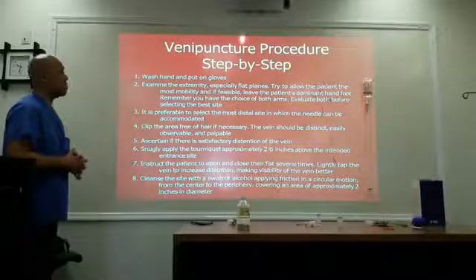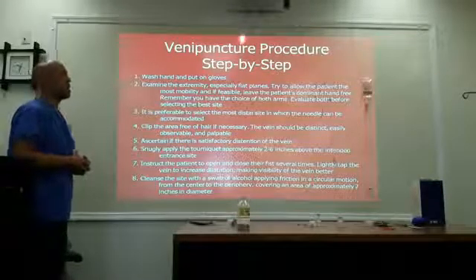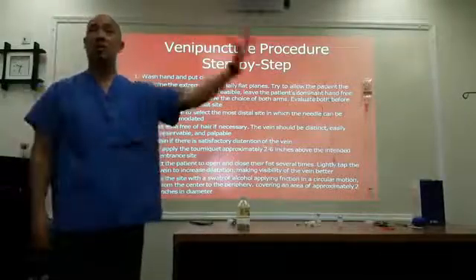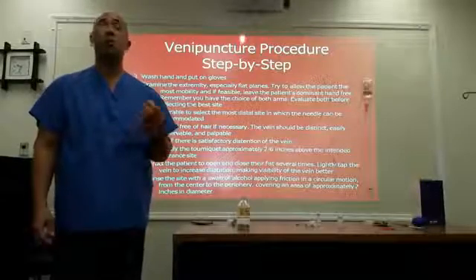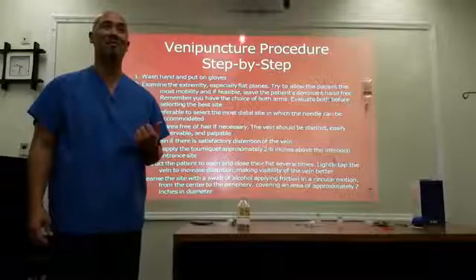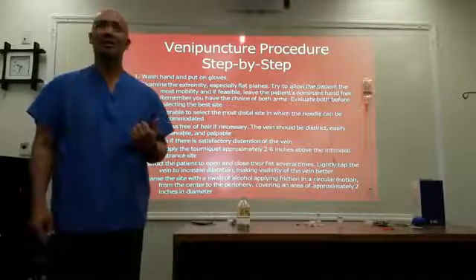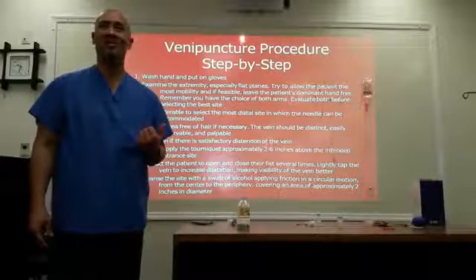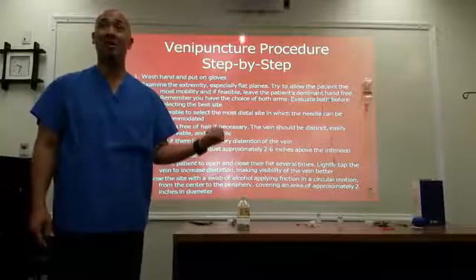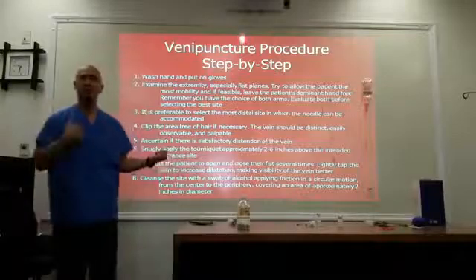Try to allow the patient the most mobility if feasible. You're going to leave the patient's dominant hand free. So in other words, you're going to stick the non-dominant arm. If you're right-handed, you're going to stick the left side. What do I tell people to do? I tell them to stick the dominant arm. Why? It's going to be more muscular and probably have the better veins, because it's the arm that you use most. So I tell people, just go ahead and stick the dominant arm. That's just me.